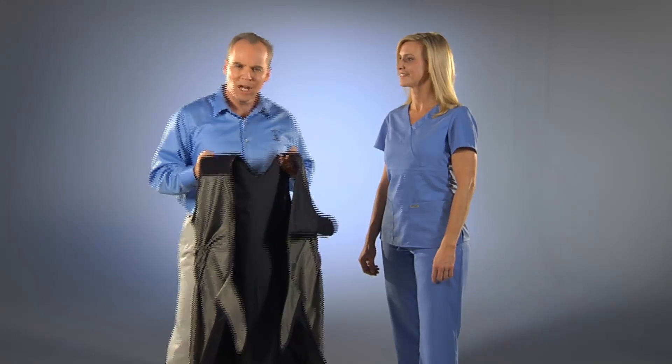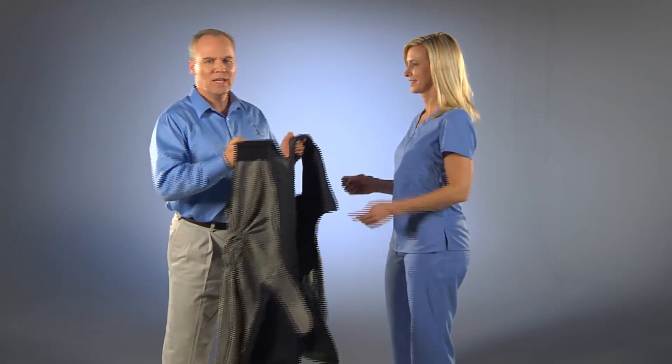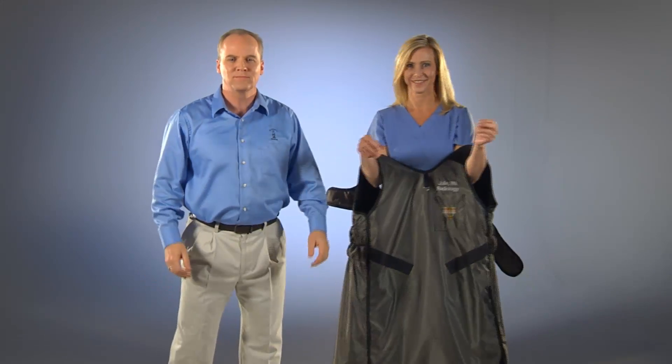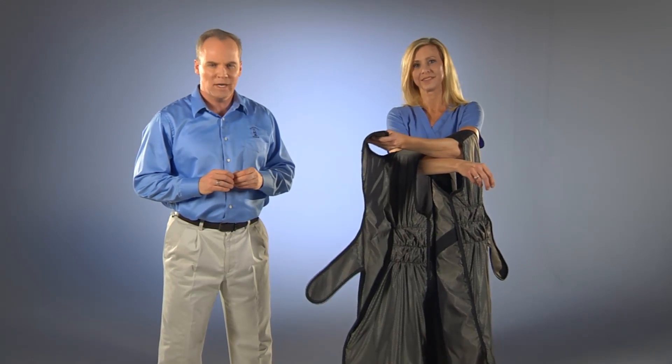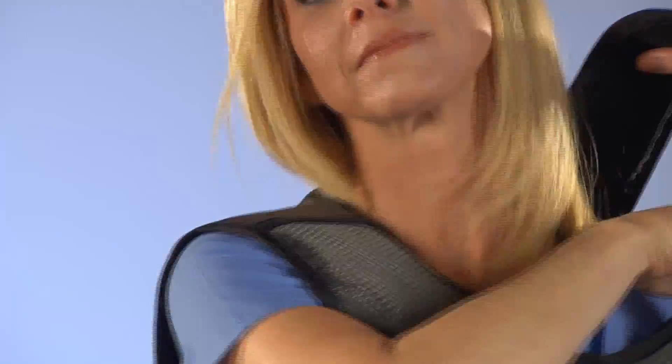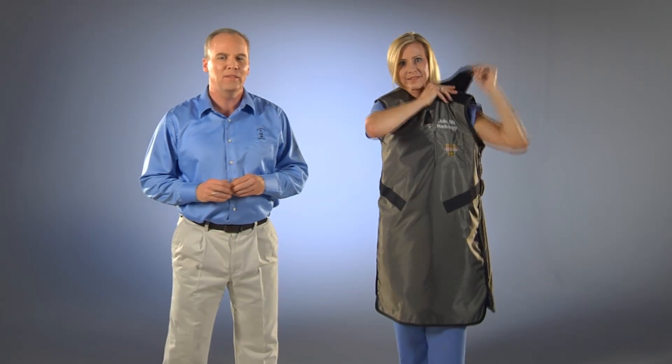Now we are going to go over how to put on and properly wear the Euro One. To put on the Euro One, simply put your hands through the armholes of the apron and rest it on your elbows. Use your left hand to reach over and grab the shoulder Velcro paw that is laying across your right arm. Then lift your left hand with the Velcro paw up and over your right shoulder and your head and place it on the Velcro patch on your left shoulder.